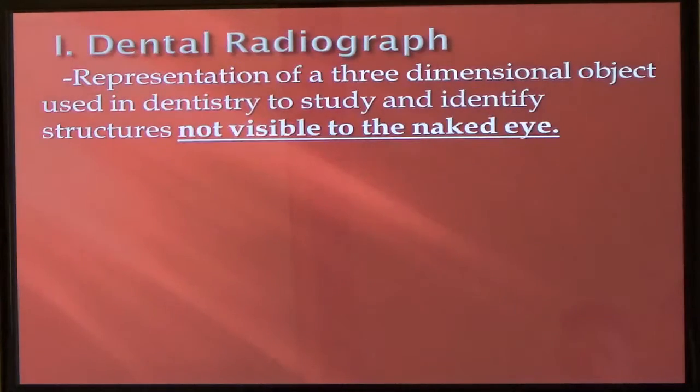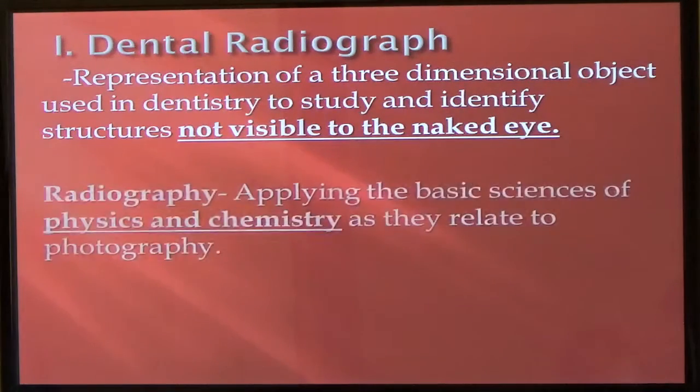So the radiograph is a representation of a three-dimensional object. A dental radiograph is used in dentistry to study and identify structures that are not visible to the naked eye. Just like any other radiograph would be used. Radiography just means we're applying the basic science of physics and chemistry, using some photography, so we can see images that obviously we cannot.